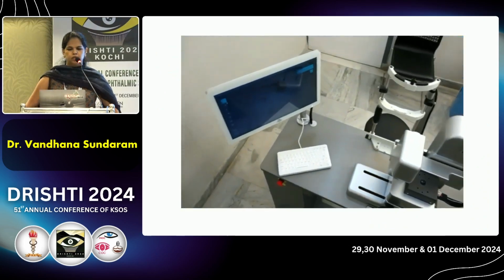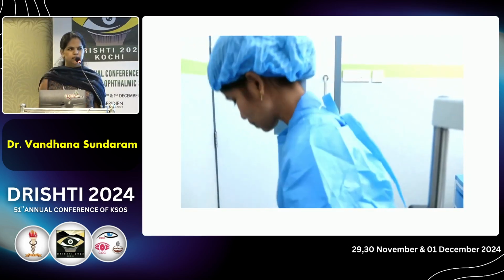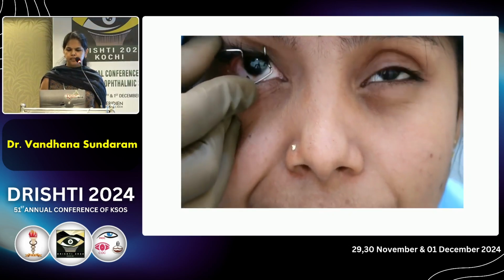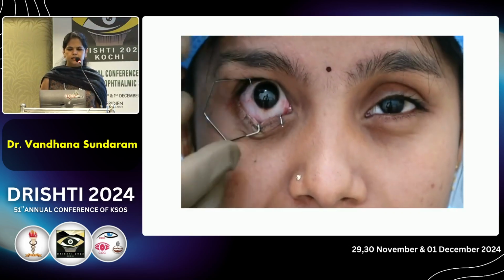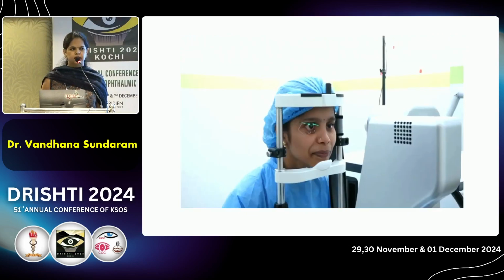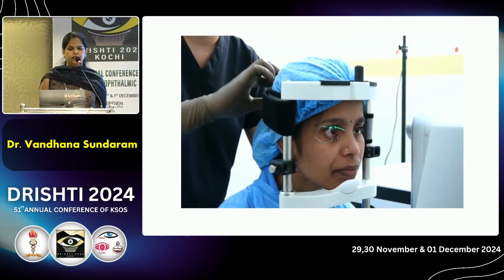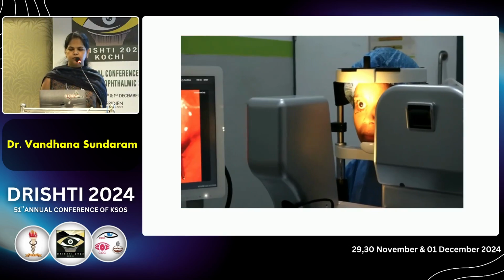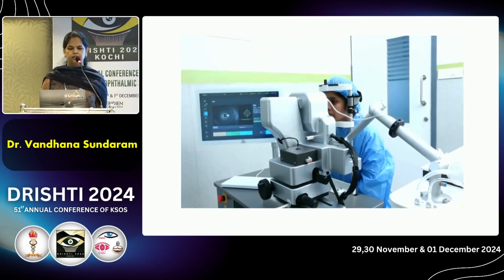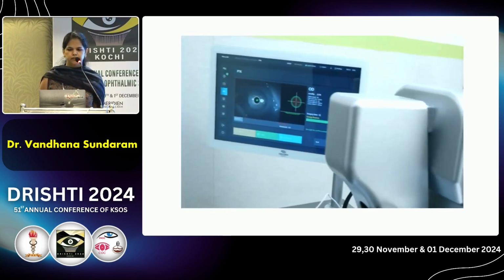This video was shot with the help of a volunteer. You can see the volunteer walking into the Sedeo room, and following this, topical anesthesia is placed and then a speculum is placed. This is similar to any slit lamp examination: the chin is kept on the chin rest of the slit lamp, and then a headband is applied to make sure that there is no movement of the head. The green light that you see there is a pupillary bisecting light. Manually, with the X and Y coordinates, we place the green light, and then the visual axis alignment is done, and then the laser is delivered with the help of a foot pedal.